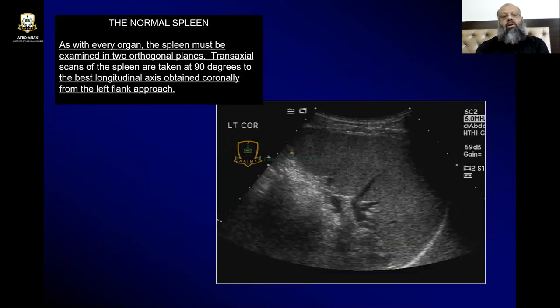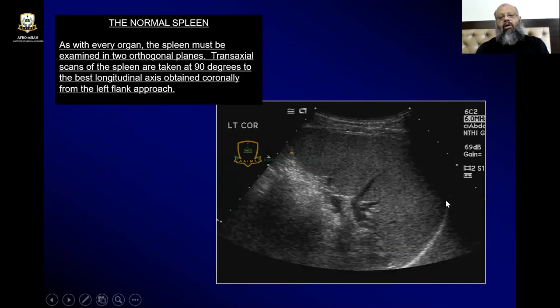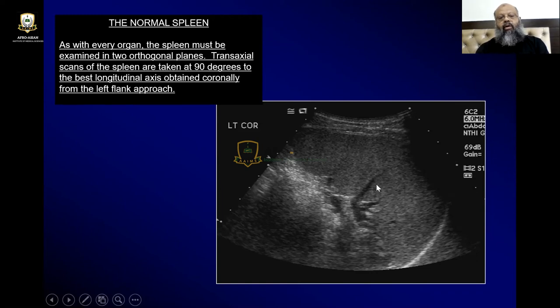Here you can see the coronal view of the left upper quadrant of the abdomen, in which we can see the splenic vessels entering into the spleen, the upper pole with the diaphragm, and the lower pole. As with every organ, the spleen must be examined in two orthogonal planes.